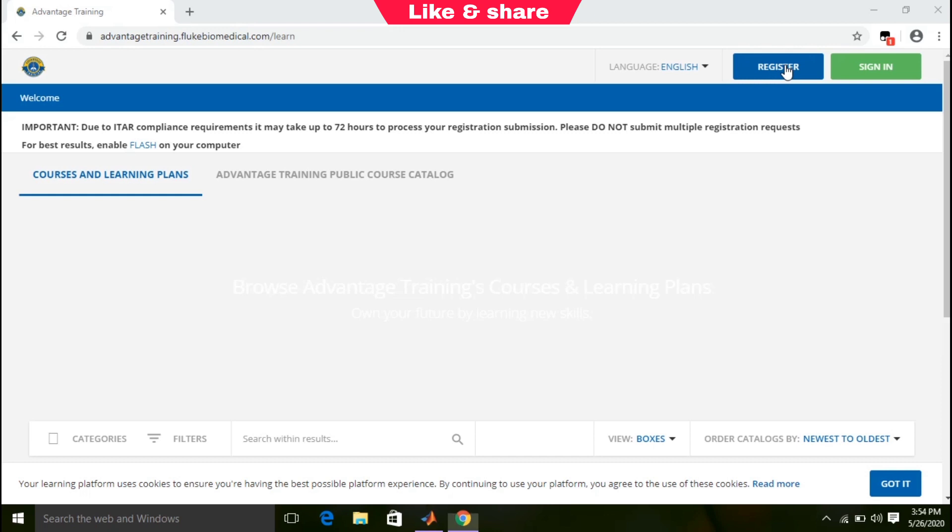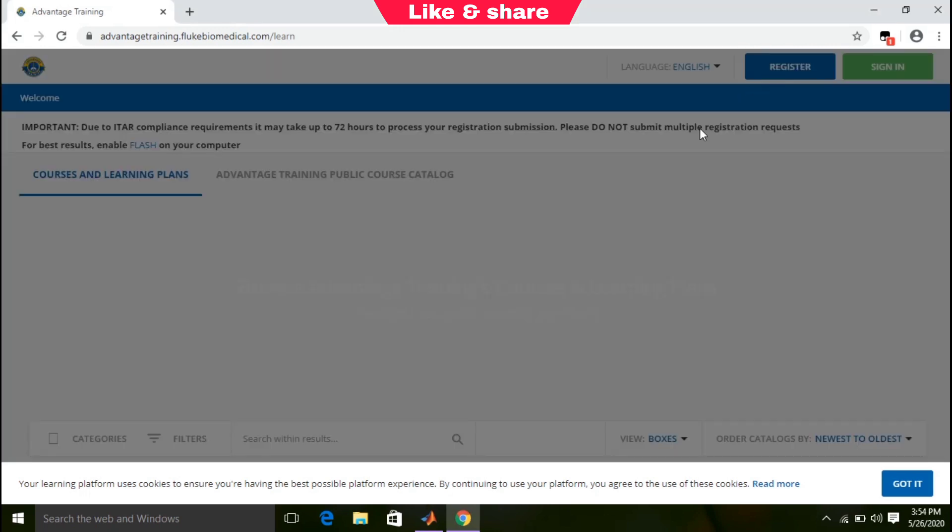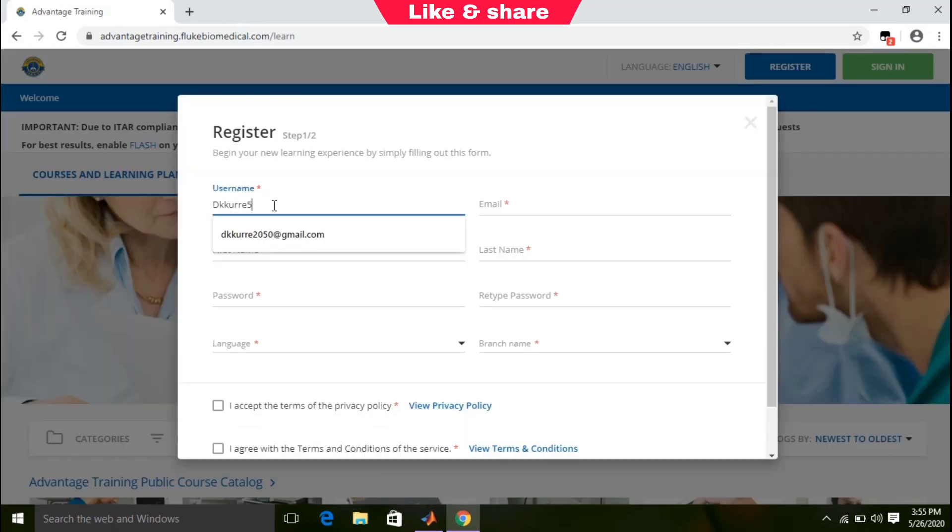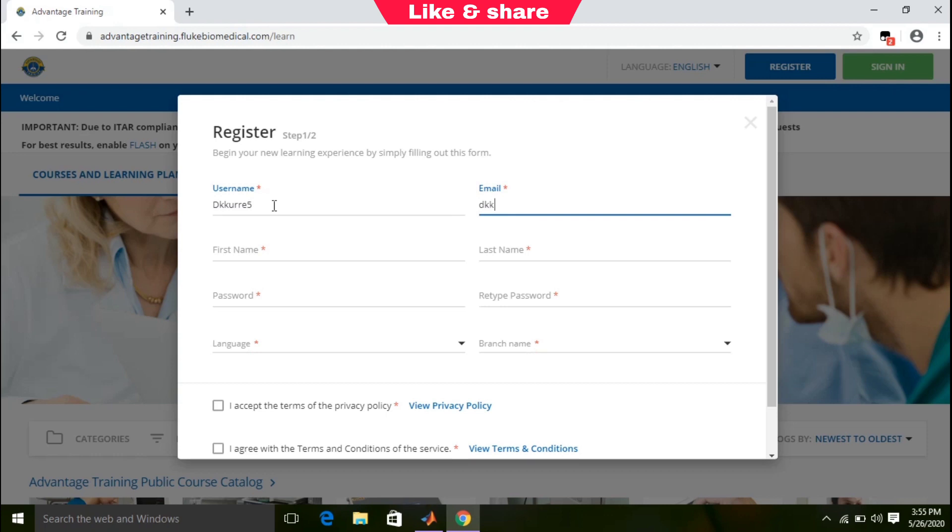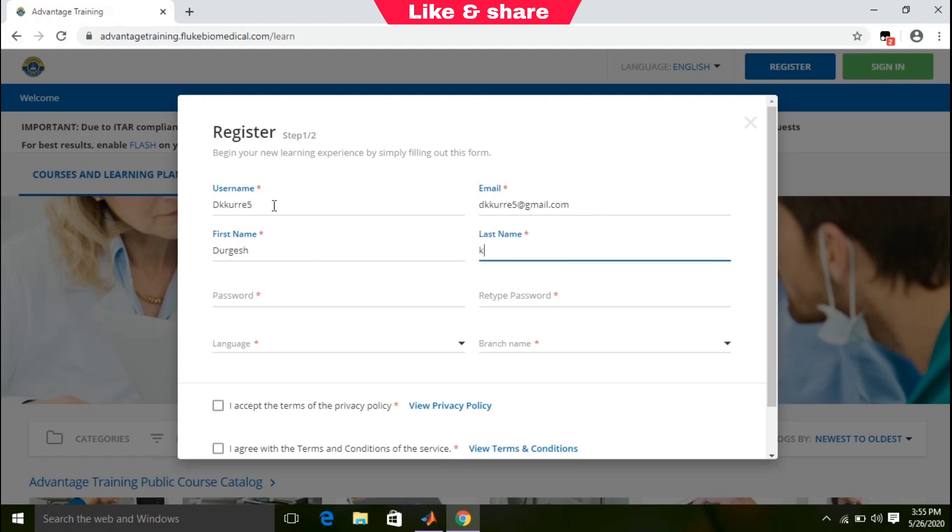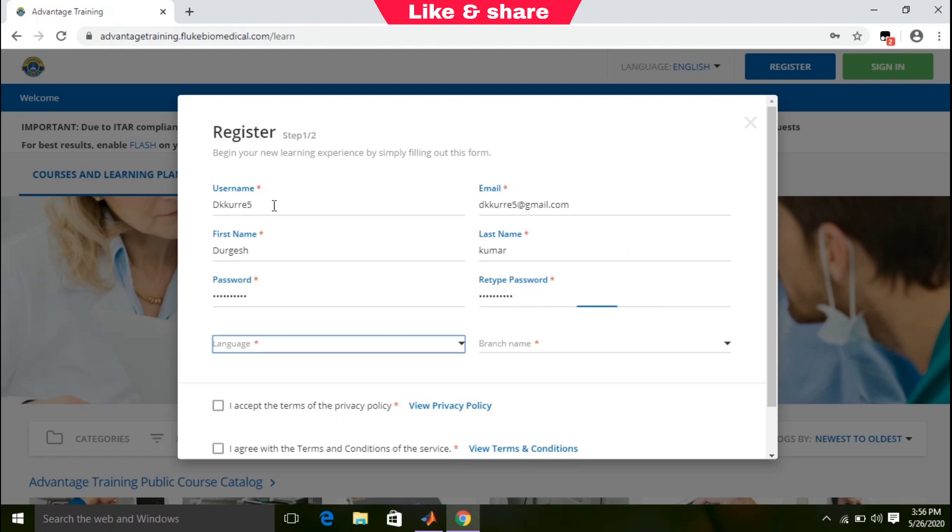To create an account, click on the register button. You need to create your username, put your email ID, enter your first name, last name, create a new password, retype password, and select your preferred language.